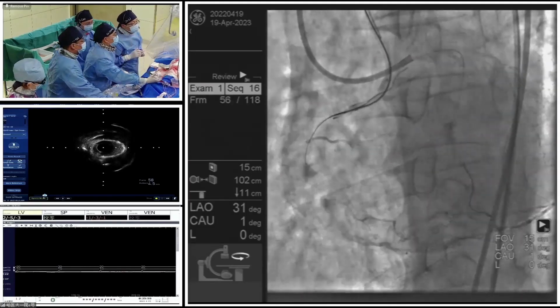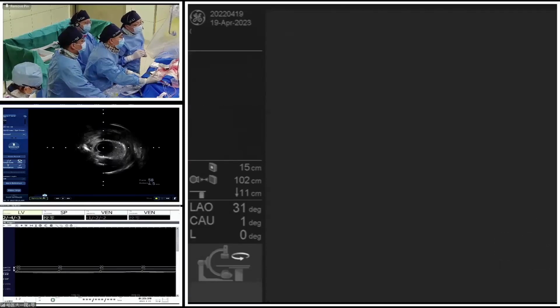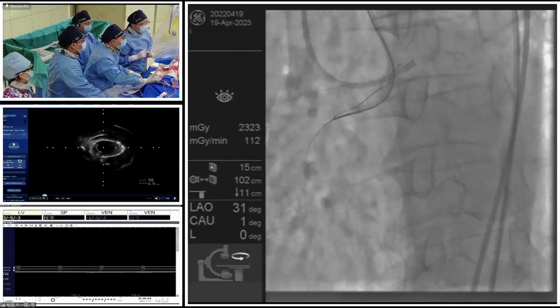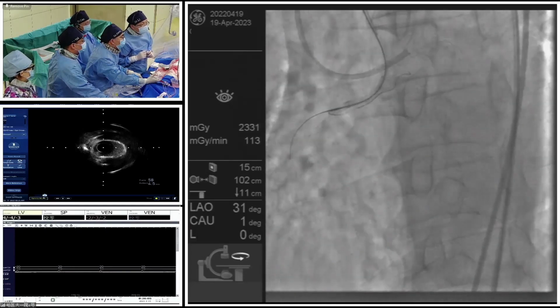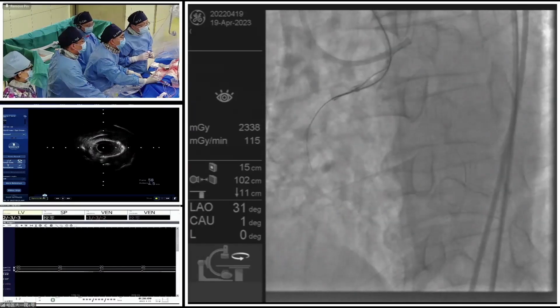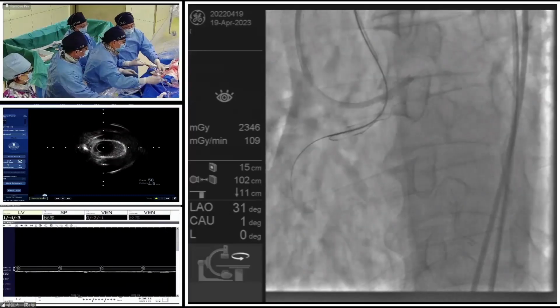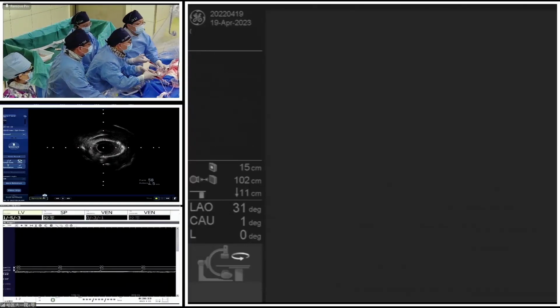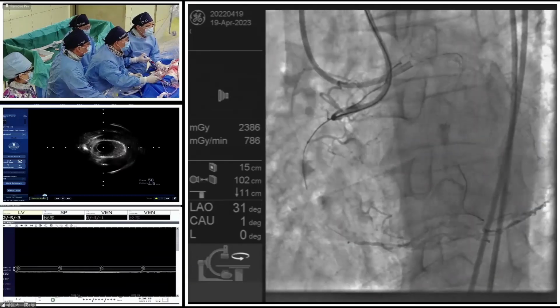I think the bifurcation at the proximal part can offer some help. For example, you can do IVUS to check the entry point, whether it's true or not. However, it causes a lot of difficulties for getting into the true lumen like this one. And the calcified plaque may also make it very difficult, blocking you from going into the intraplaque area.